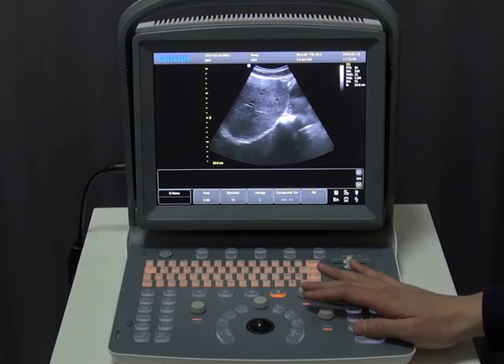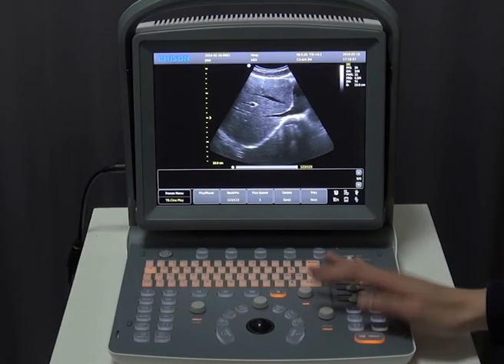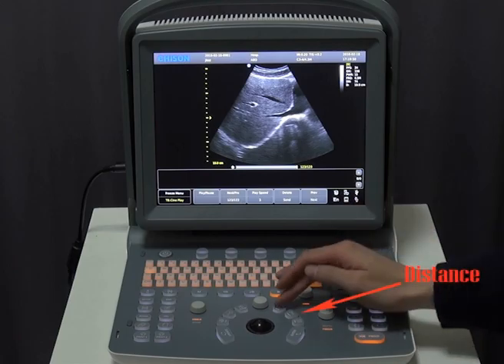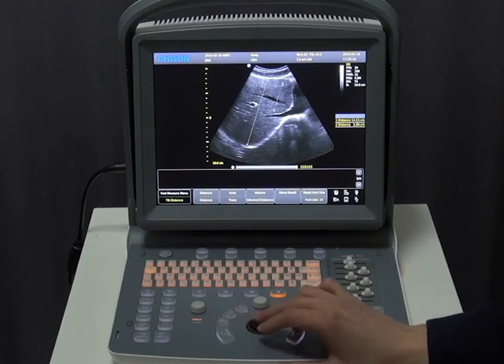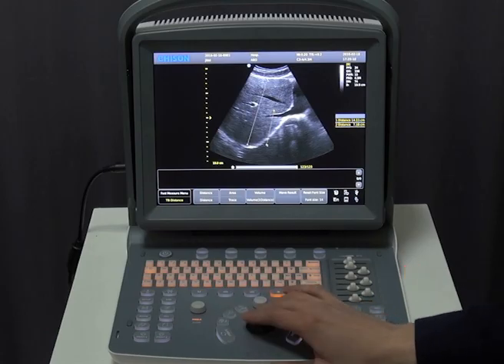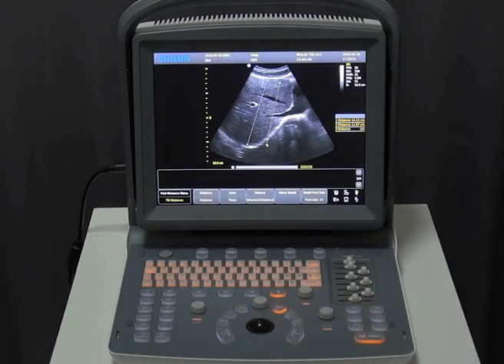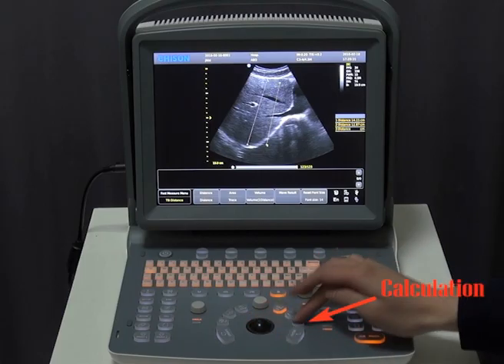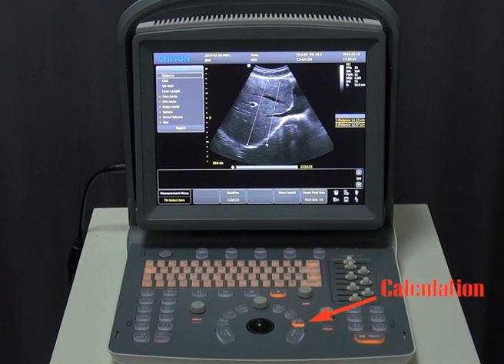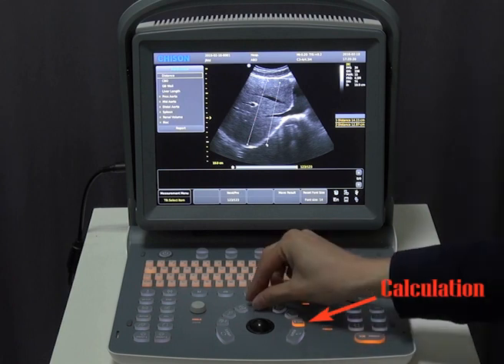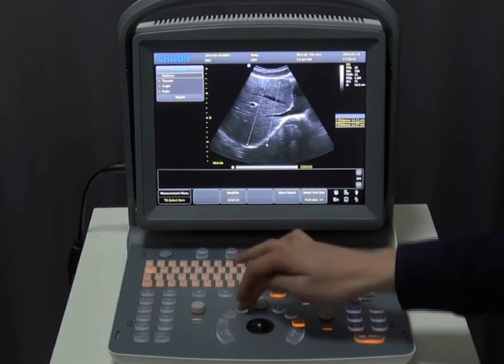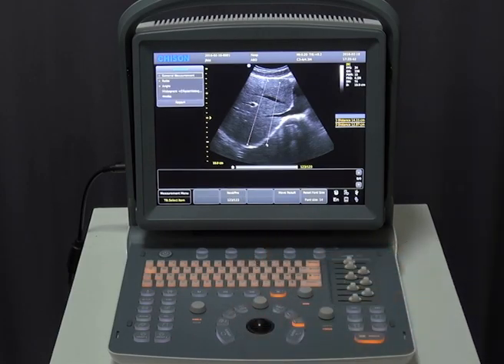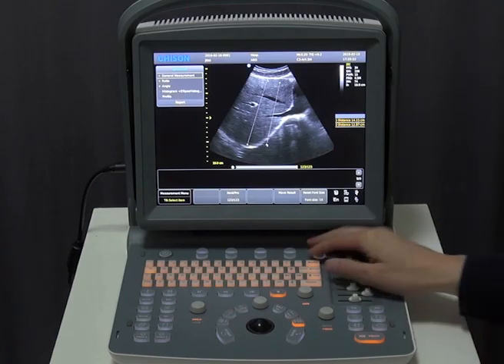After getting a high quality image, we need to do some measurements. Let's take distance measurement as an example — press the Dist button and you will see a line segment on the interface. Press Update to change the active point and move the trackball to confirm the position. For professional measurements, hit Calc to open the calculation menu, which shows all abdomen calculations. Press Change to change the calculation menu, and adjust font size and positions as needed.